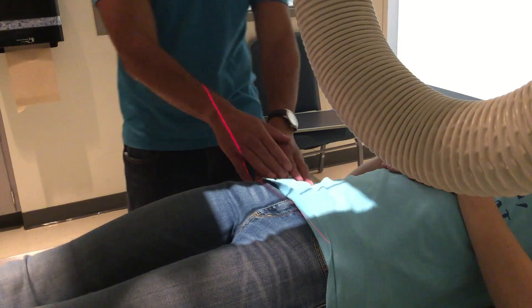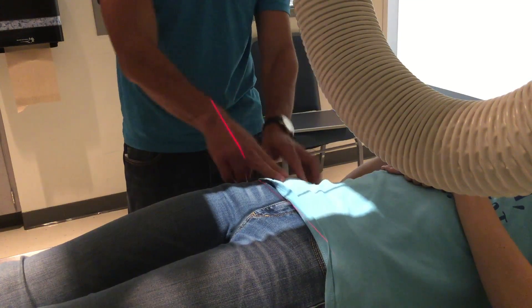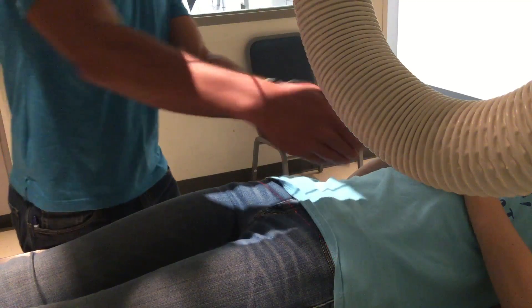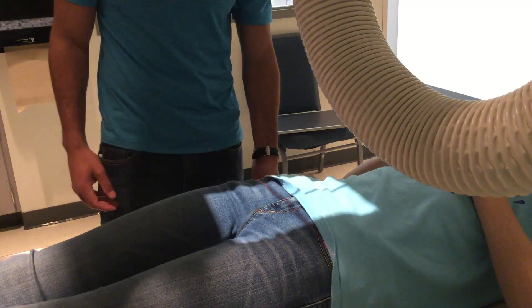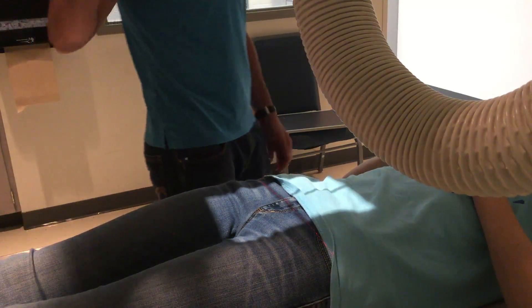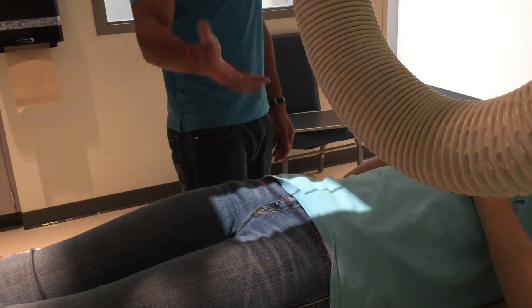So we'll start with the AP axial — I already kind of set it up. ASIS, two inches below. You have to imagine the sacrum comes in like this, and it's dead in the middle of the pelvis. That's what your AP sacrum is. You can come in a little bit, you don't have to. There it is.